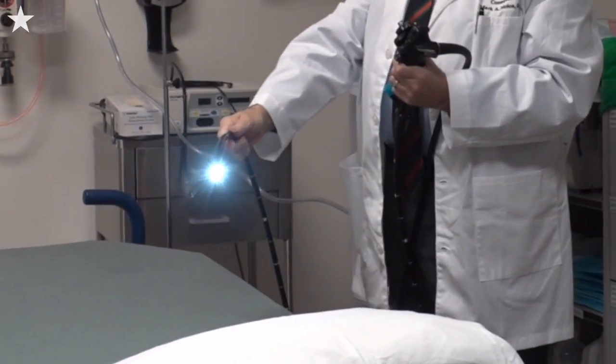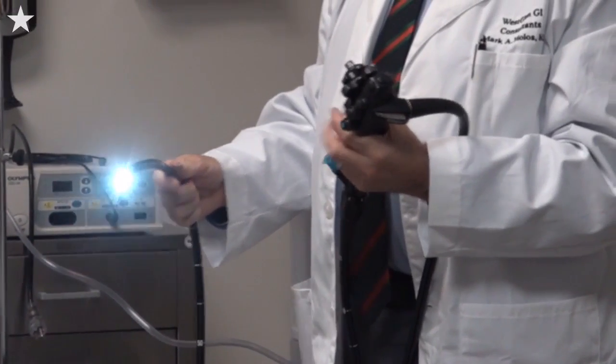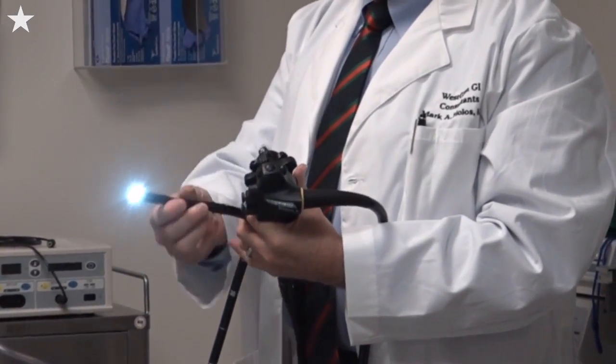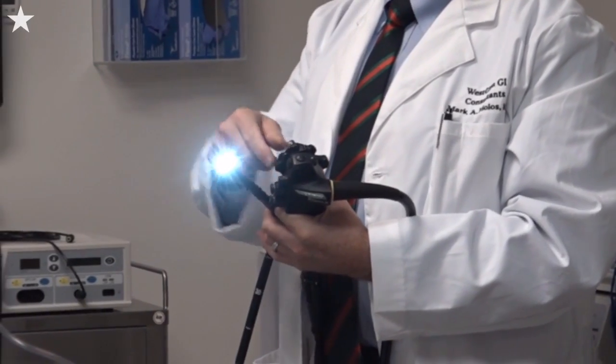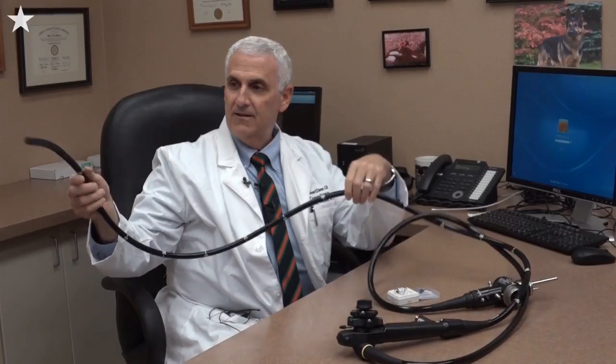Typically, colonoscopy is an examination of the colon that we do and it's been around for a long time. Most patients are familiar with it — they come prepped and sedated to our actual endoscopy lab. They're put to sleep under a general anesthetic. Once asleep, we advance this long black tube throughout the length of the colon and take pictures inside.